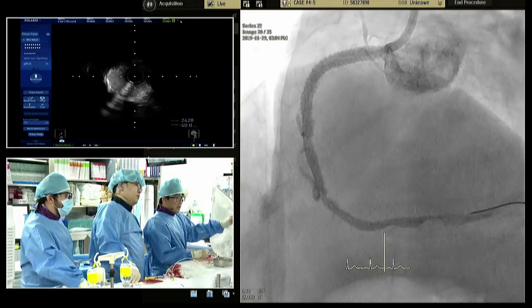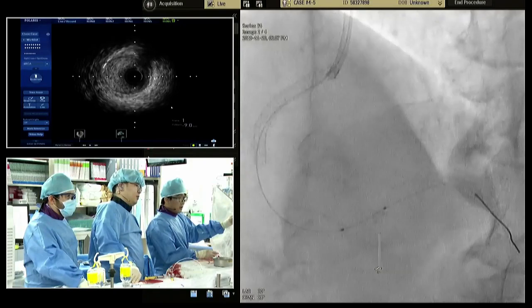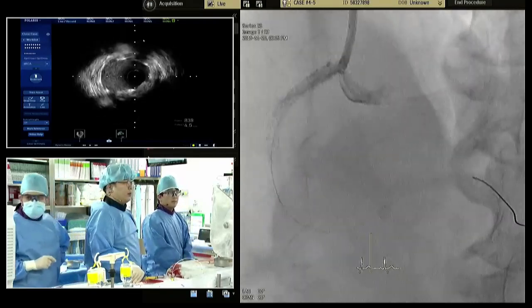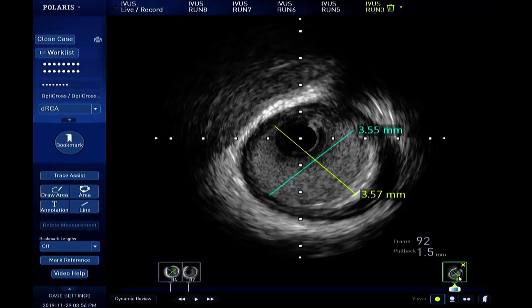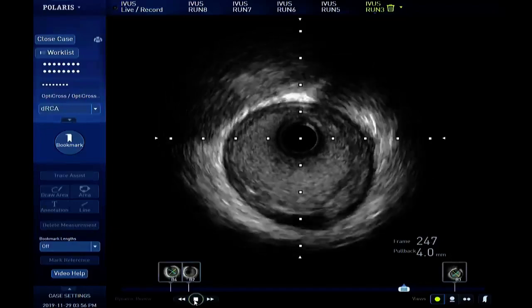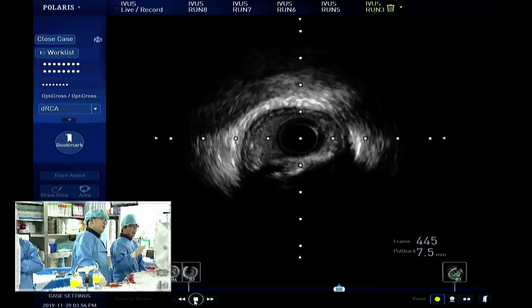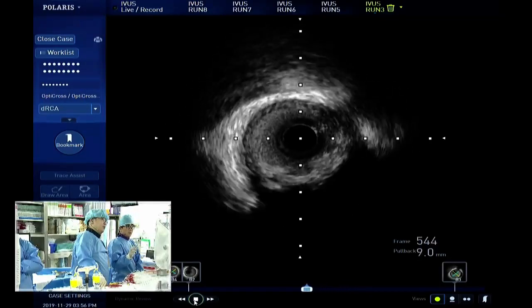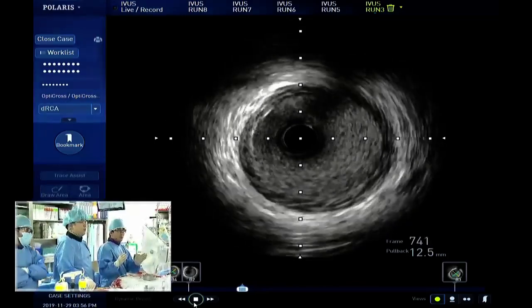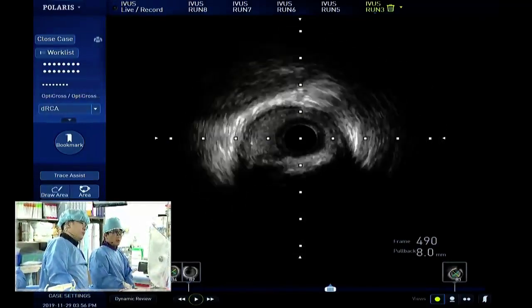And then what I did was, I wanted to treat the distal. There is an eccentric calcium you can see there. And I saw the IVUS first. Can we see the IVUS for the distal? Baseline. Okay, this is the RCA. This is the proximal portion of the PDA and bifurcation. You see a tight stenosis here, superficial calcium, very discrete. The proximal and distal landing zones are about 3.8 to 4.0, and the vessel size at the culprit lesion is about 3.8 to 3.9.